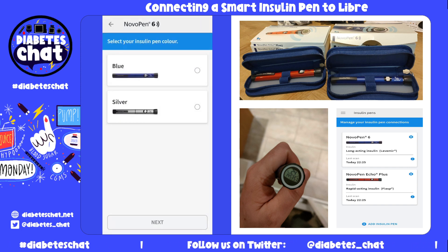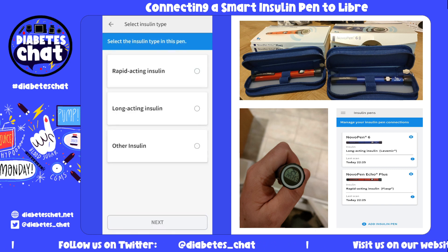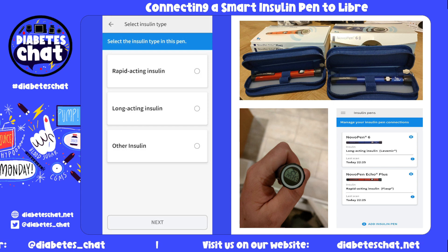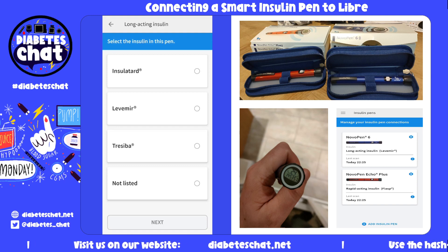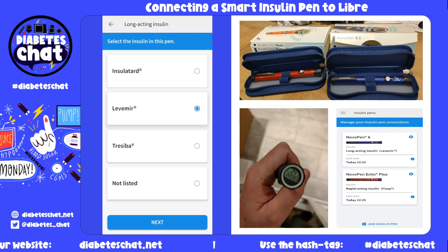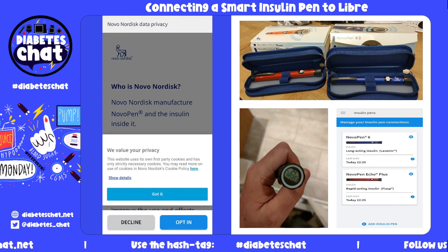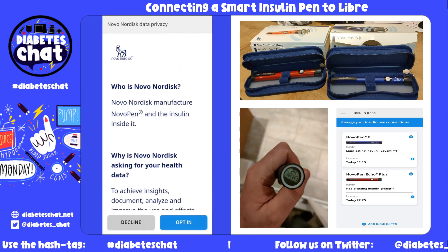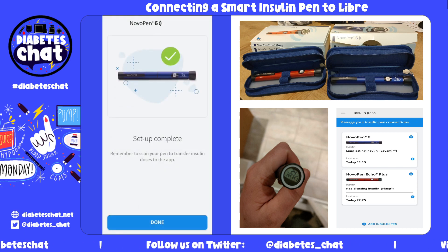I'm going to choose which colour the insulin pen is — I've got the blue version. Next, record what type of insulin this pen is used for — it is for my long-acting. You can then choose the type of insulin that you use. I'm going to click on mine and it will load. You can accept or decline the data privacy, and it will say your setup has been completed.